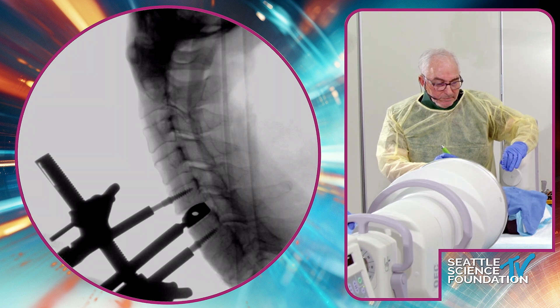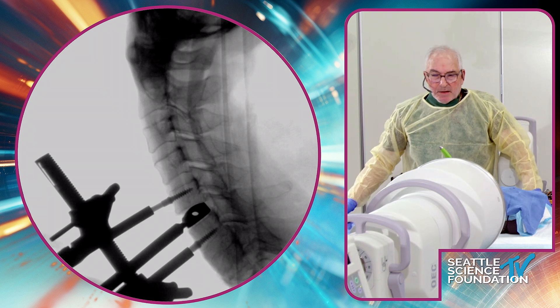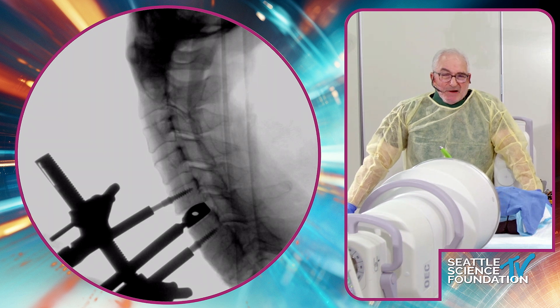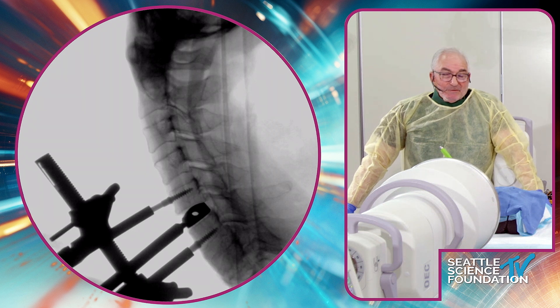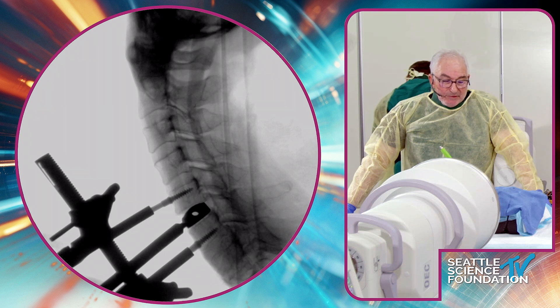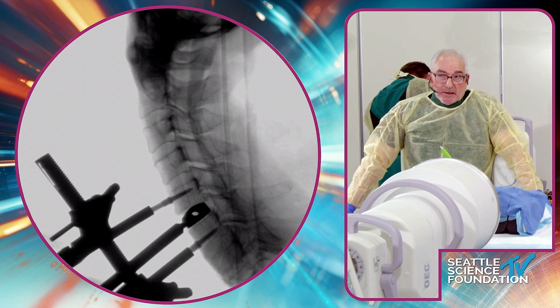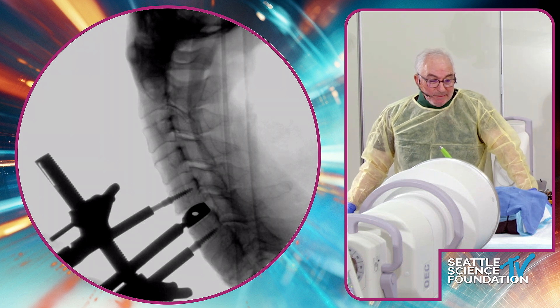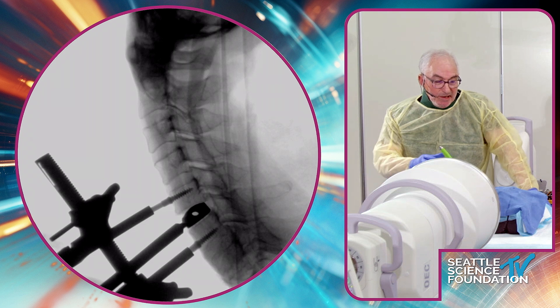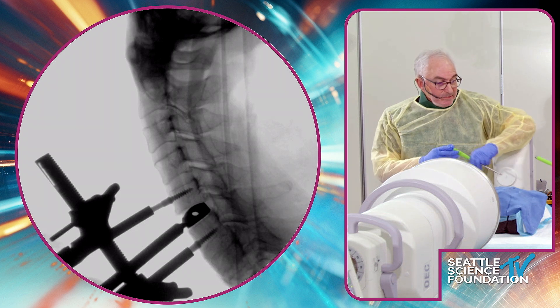As for end plate work — if there's fibrous tissue or disc material remaining, you want it to look just like a first-time disc replacement, with cartilage and disc gone and just the bony end plates visible. But you don't want to violate it like a first-timer, because then you risk subsidence. So that's a great point — freshen it up without compromising the end plate integrity.